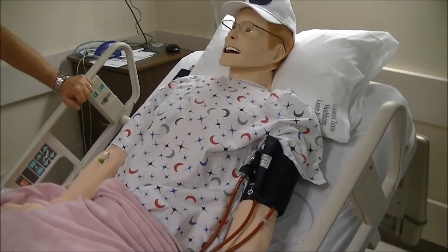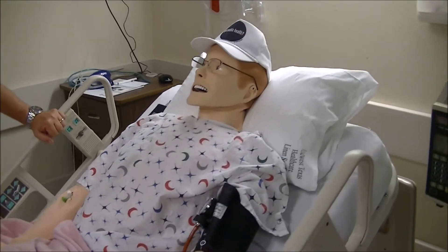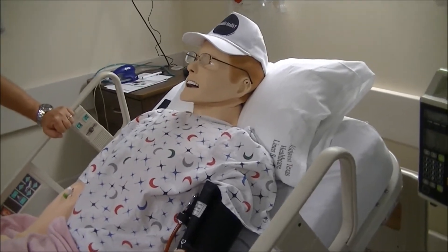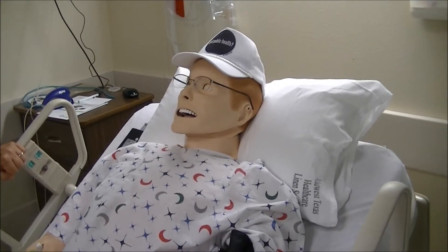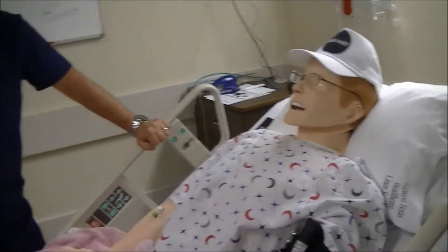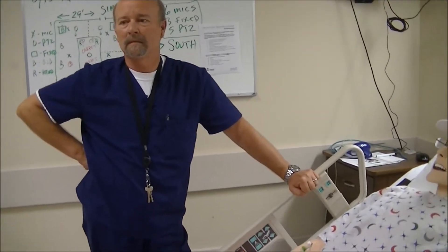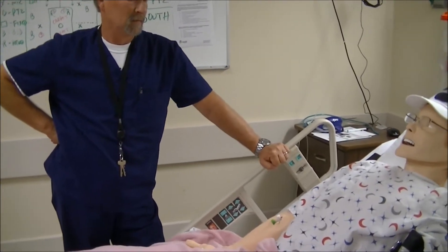We are back to the Simman 3G and his pure awesomeness. We discovered today that Simman has a very large head, and we had to adjust our Got Public Health hat a couple of times before we were able to get it on his big old chunky head. Today we're going to do something a little different. We are here with Phil Howell, the Stat Lab guru. He's going to tell us a little bit more about what this guy can do through the wireless connection. So Phil, what are we going to talk about today?